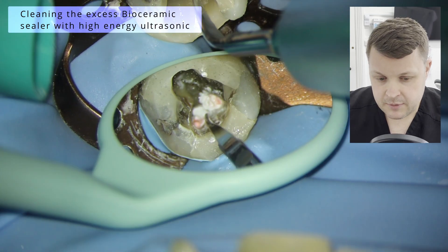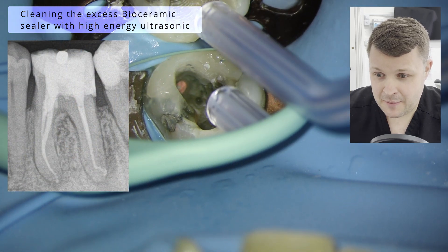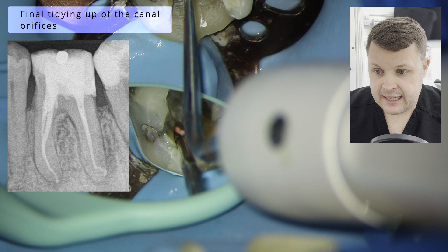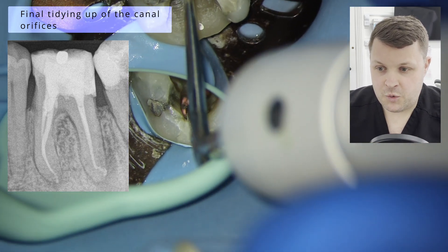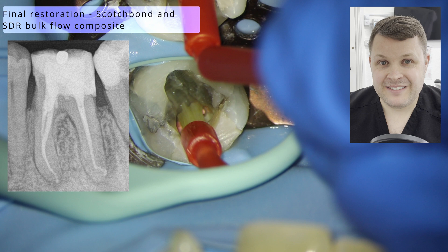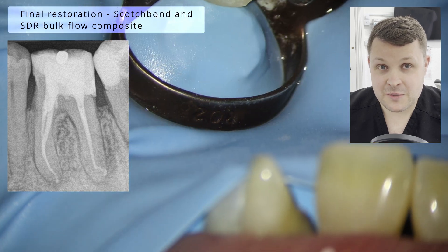And if you've correctly apically gauged this tooth, then you'll be fine. You can see on the post-op that there is a quiet and tight 90-degree bend in the distal canal, and the use of a bioceramic has helped it all flow nicely. Looks super nice.